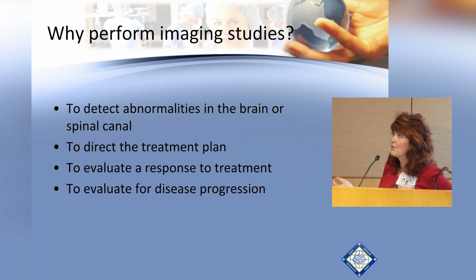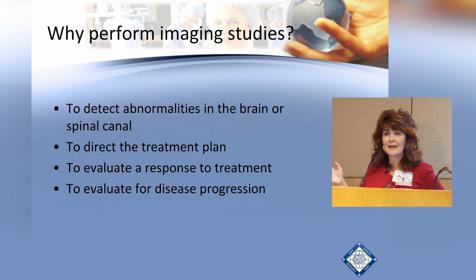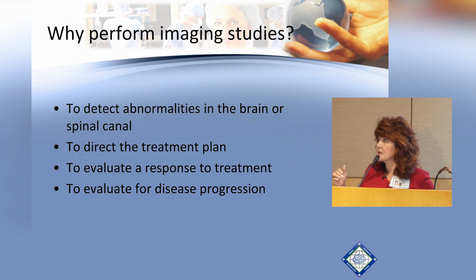So why do we perform imaging studies? It's really to detect abnormalities in the brain or the spinal canal. It's also to direct the treatment plan. It's to evaluate our response to treatment, and also to evaluate for disease progression.